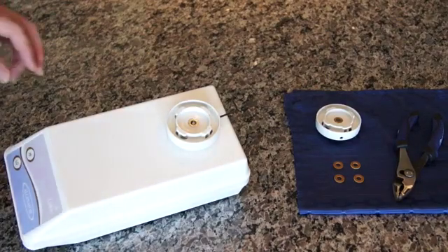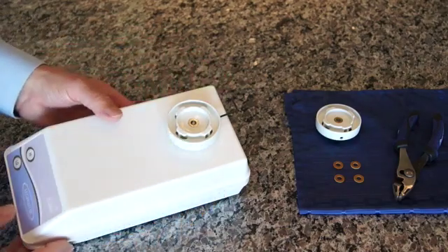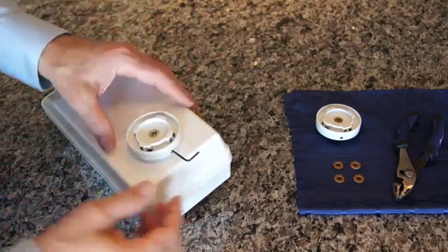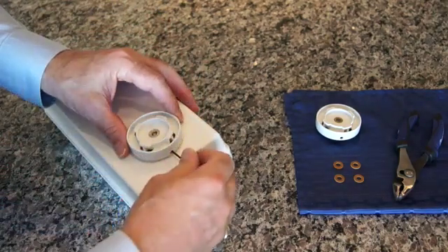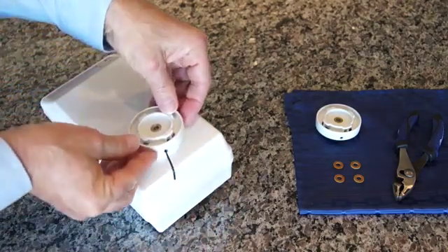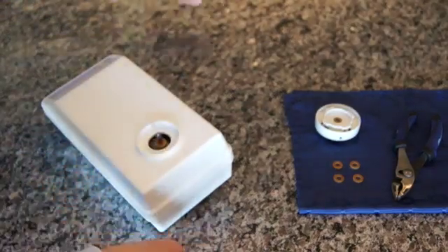The purpose of this video is to replace the hub that's located on a 2-speed Alginator. I have placed an Allen wrench into the small hole on the side of the hub. Loosen it, pry it up, and that will be discarded.